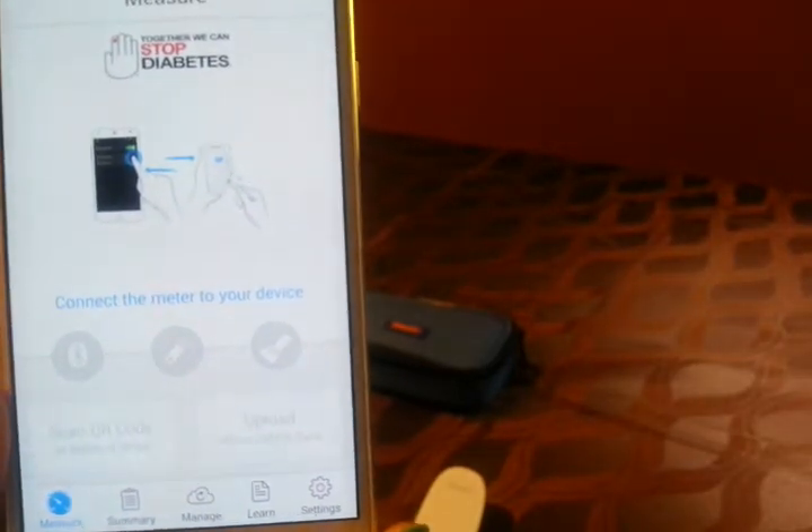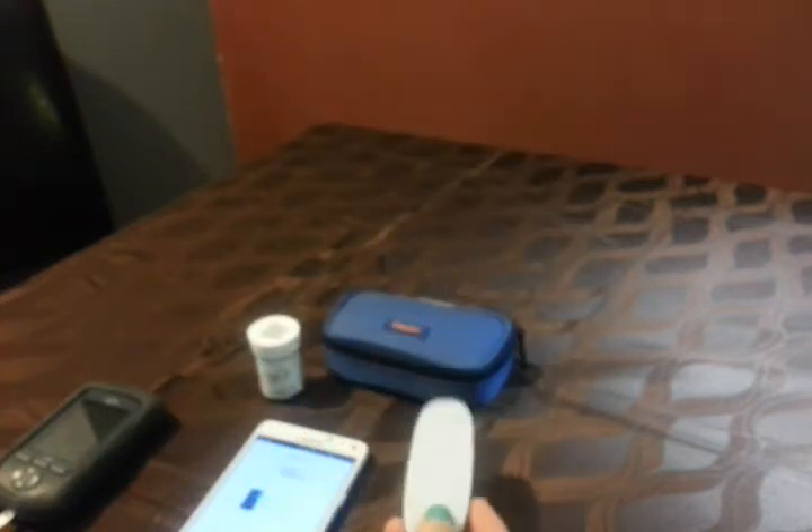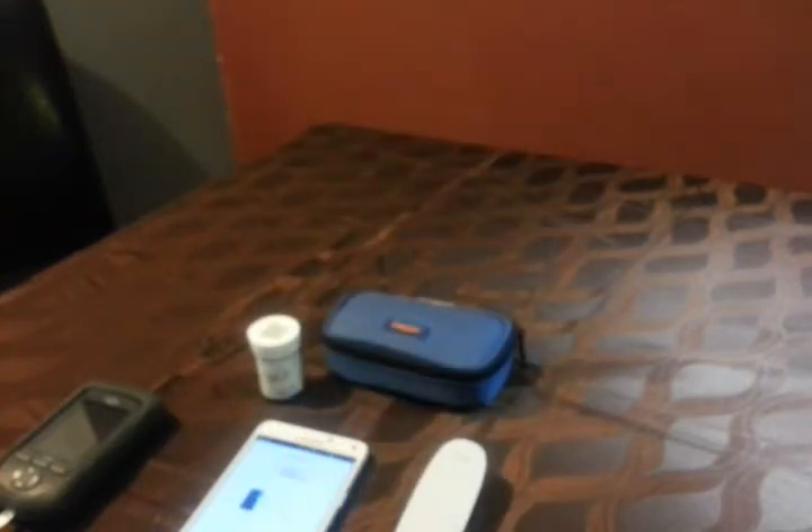I was kind of expecting the interface to be a little more space-aged since this looks like a space-aged item, but I kinda like it. I like that you can send text messages with your blood sugar readings. Anyways, that's my small review — I just wanted to show it because I couldn't find a lot of videos on it, and it's a pretty neat upcoming item. Hopefully the insurance will cover it.